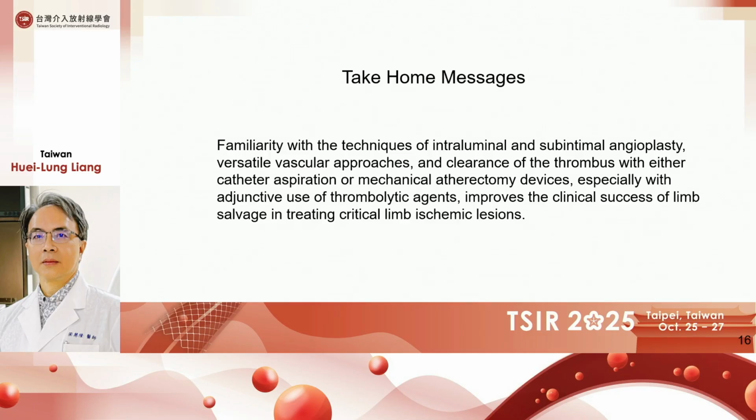Take-home message: familiarity with the technique of intraluminal and subintimal angioplasty, versatile vascular approaches, and the clearance of the thrombus with either catheter aspiration or mechanical atherectomy devices, especially with adjunctive use of thrombolytic agent, improves the clinical success of limb salvage in treating critical limb ischemia.